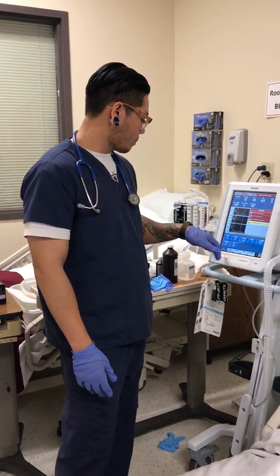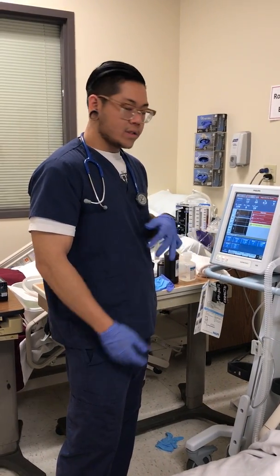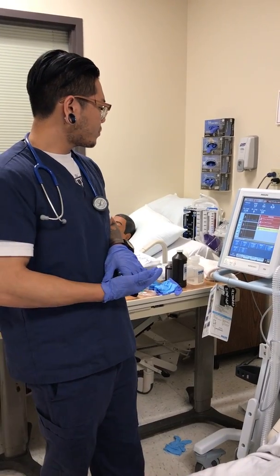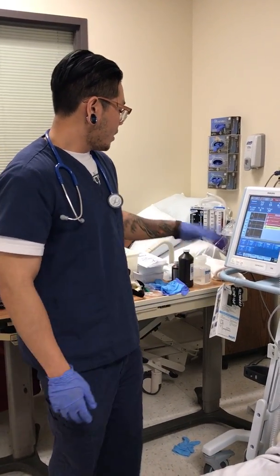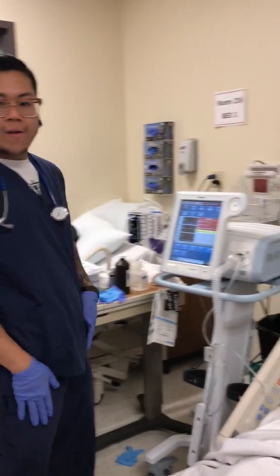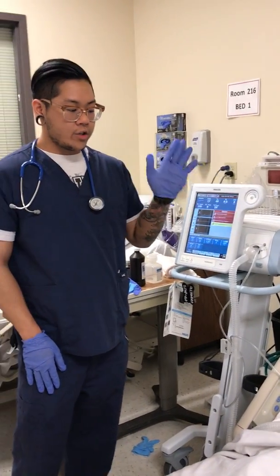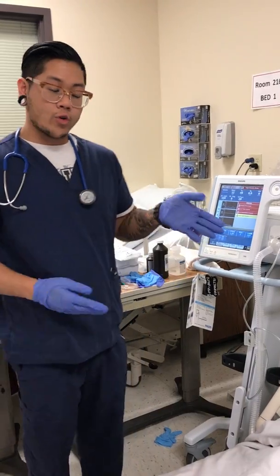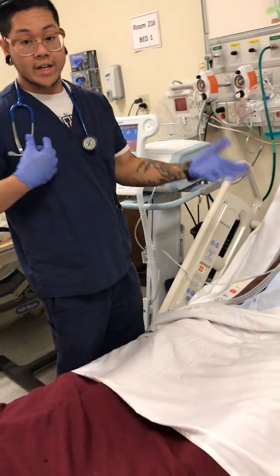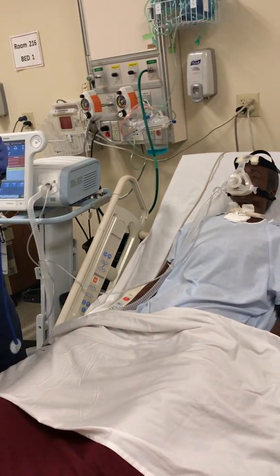Okay, so I already talked about spontaneous trigger and cycle. After you do that, remember to chart, but you also need to reassess the patient. So go back and take a listen. You should be hearing air, so that's how you know it's working and it's helping. So let's take another listen to Mr. Parker over here.